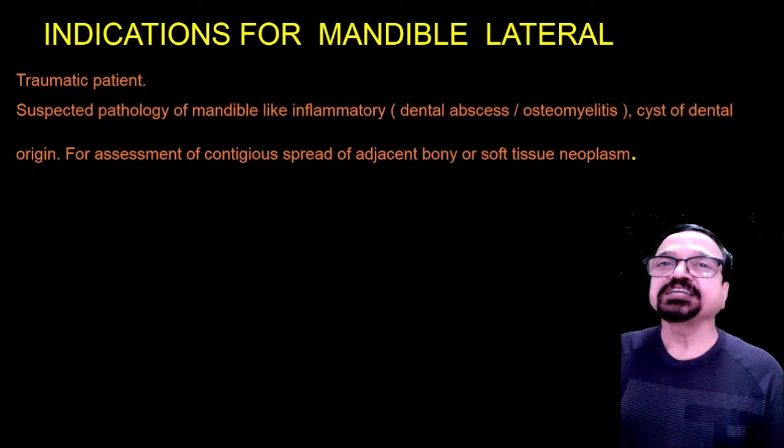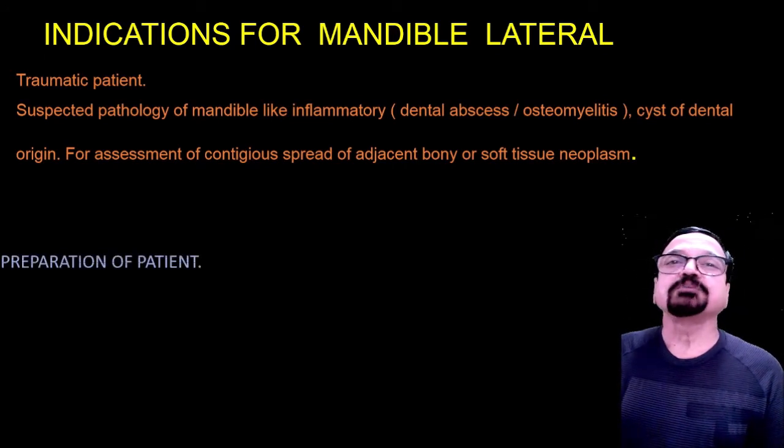Now, what are the indications for mandible pathologies? One is traumatic patients. Then suspected pathology of the mandible like inflammatory conditions, dental abscess, osteomyelitis, cysts of dental origin, and for assessment of contiguous spread of adjacent bony or soft tissue neoplasm.